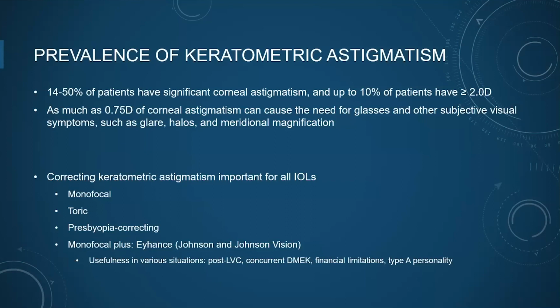And sometimes some surgeons may feel that they're not really getting this increased near and intermediate vision with this lens. If we're not correcting all of the astigmatism, especially if there's against the rule astigmatism, then it's like buying a Porsche but only driving 30 or 40 miles per hour, really not unlocking the full features of that device. So there's a lot of keratometric astigmatism out there.